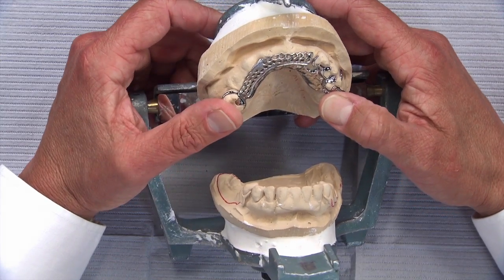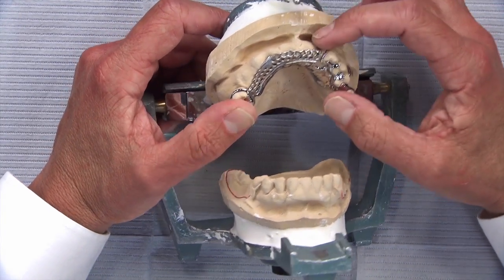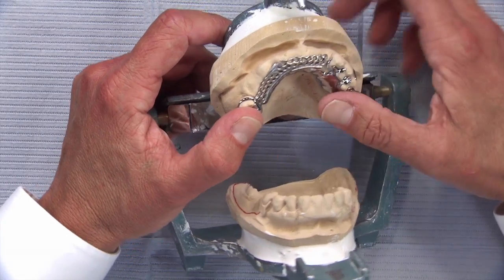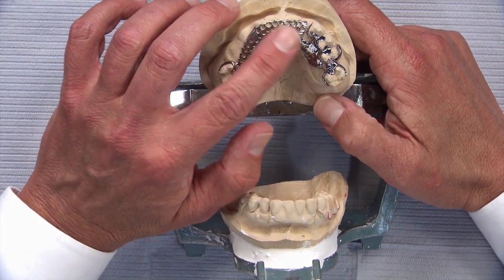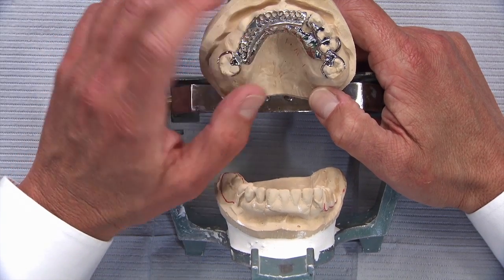And so there's an undercut on the mesial, and the opposing does not interfere with the lingual. And so there's room to come off the cingulum and wrap this around the lingual and onto the mesial into that undercut. The doctor approved the horseshoe major connector that matched the patient's existing partial denture.